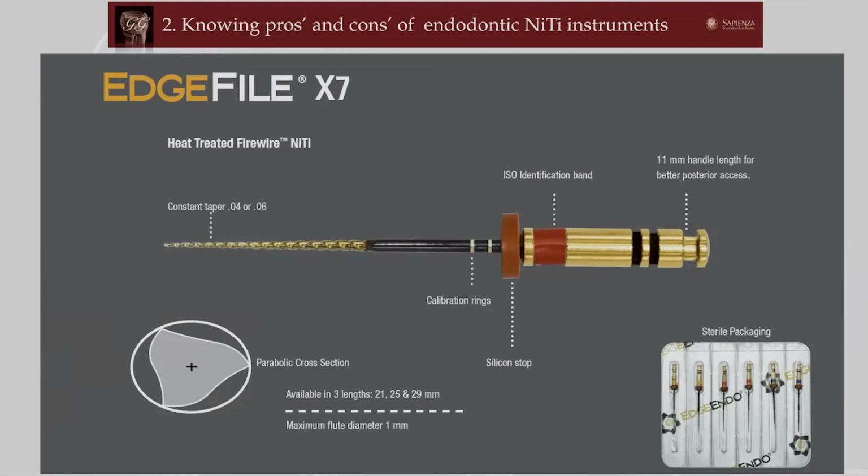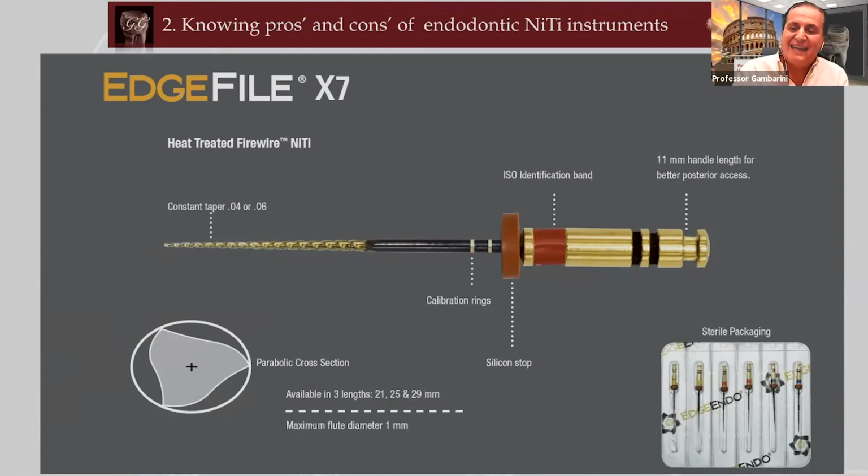Right. And then you touched on it at the end briefly, but why do you increase the speed and reduce the torque when preparing the canal? Well, when I'm getting out, I do this because it makes flaring, or it makes cleaning by touching all the canal walls faster and more efficient. I don't increase the speed when I'm getting in.